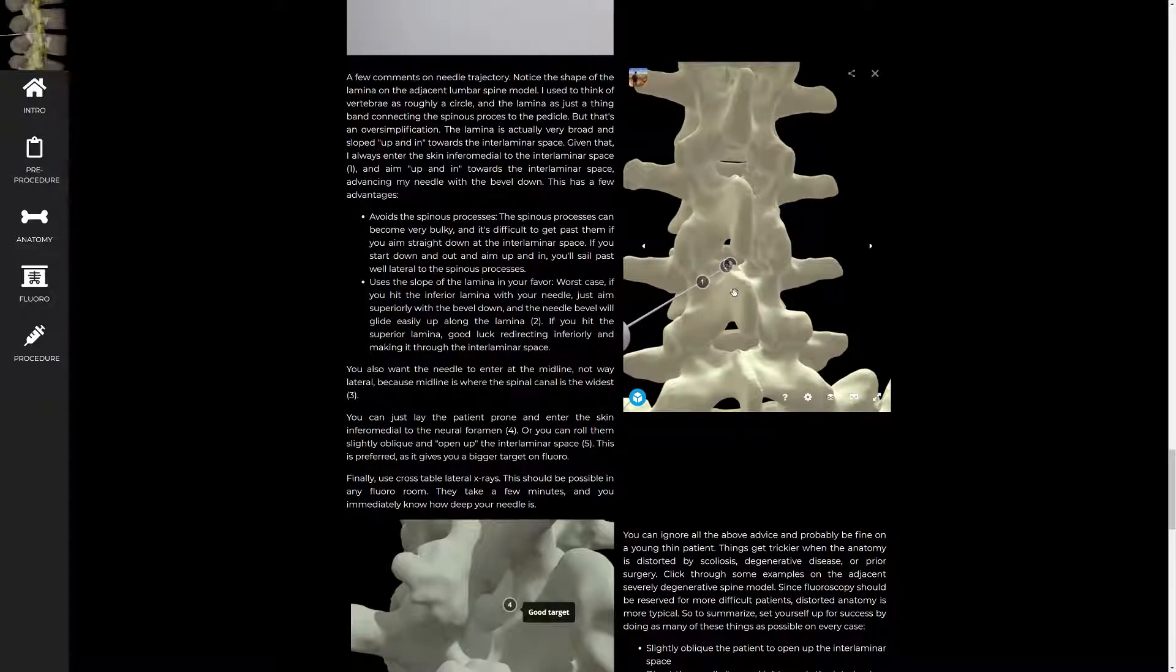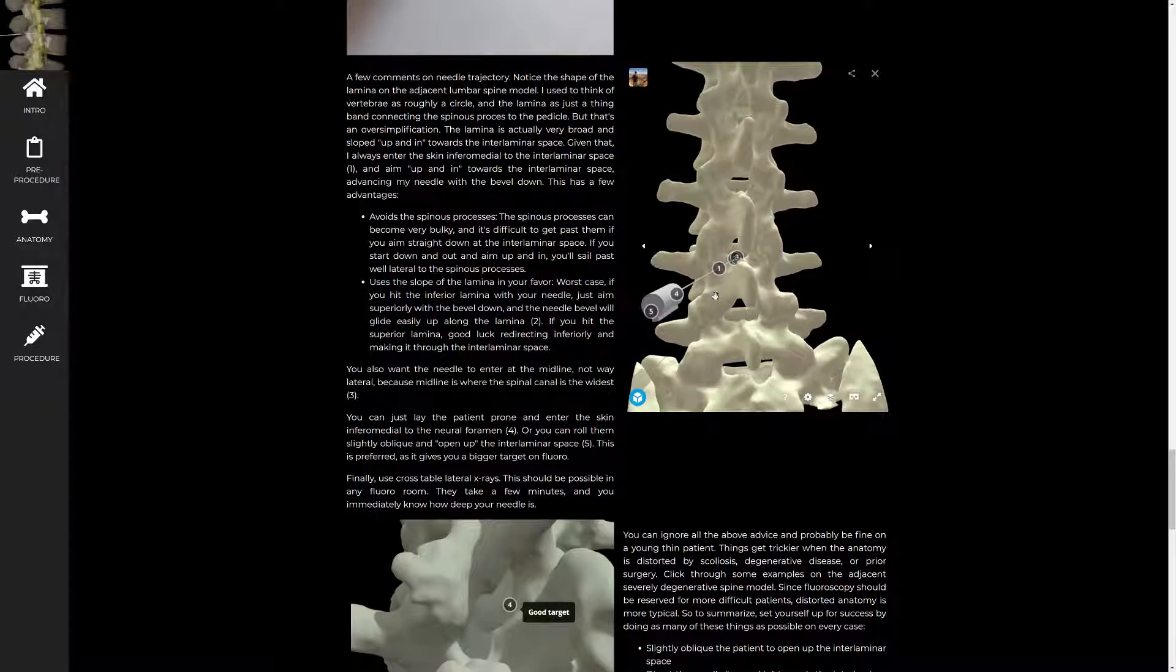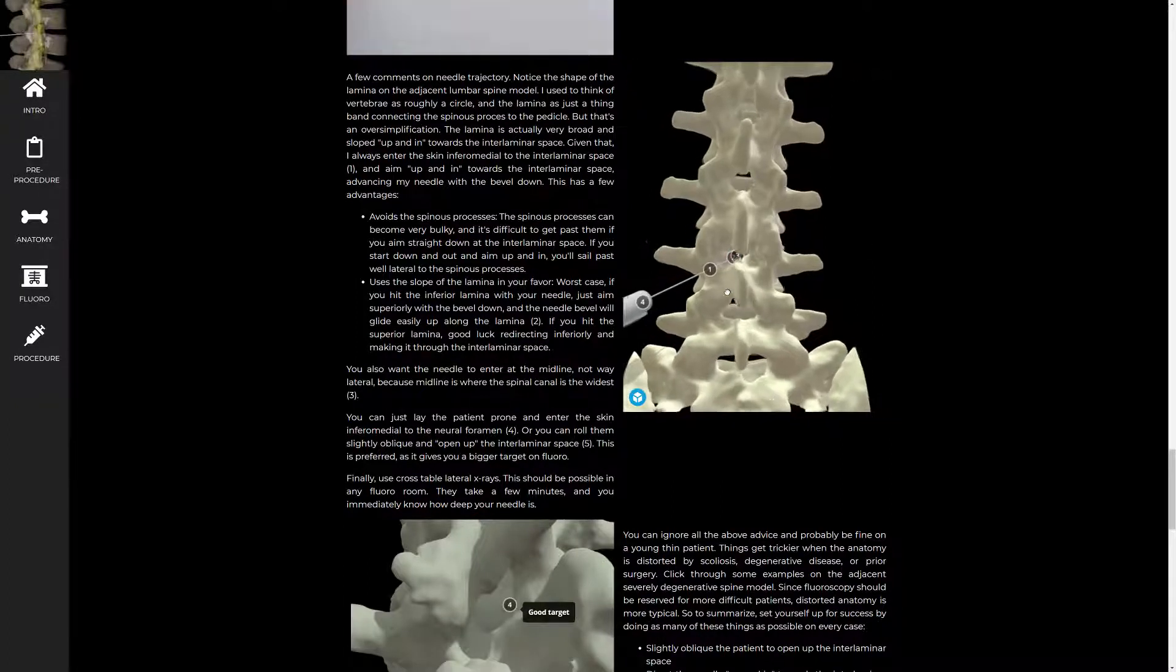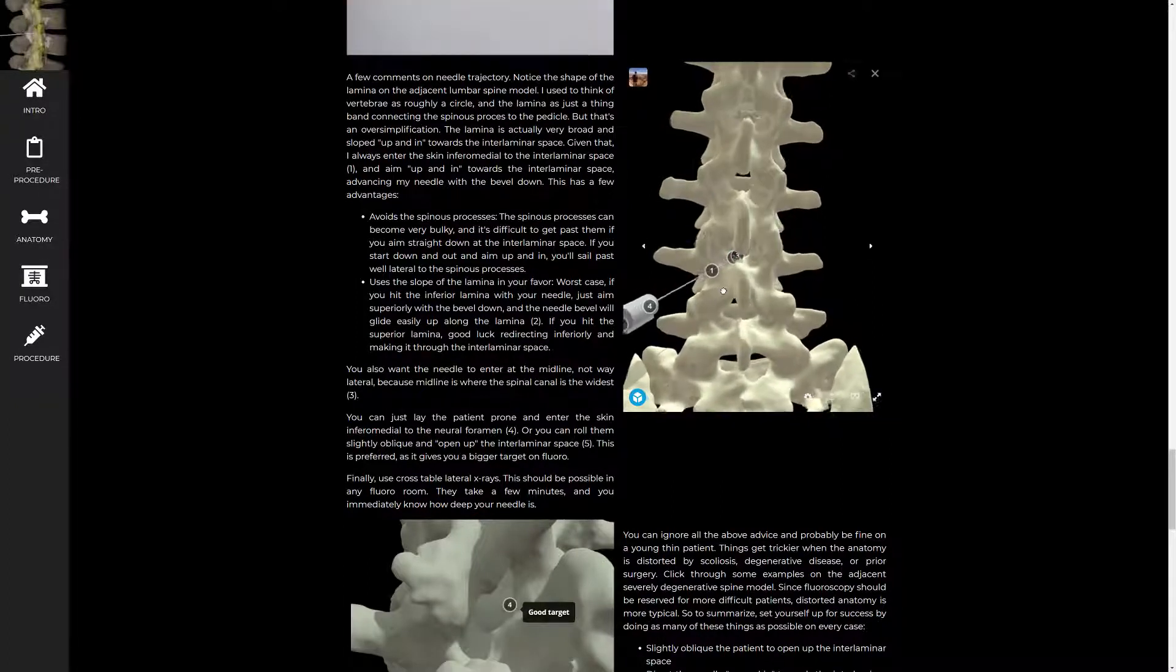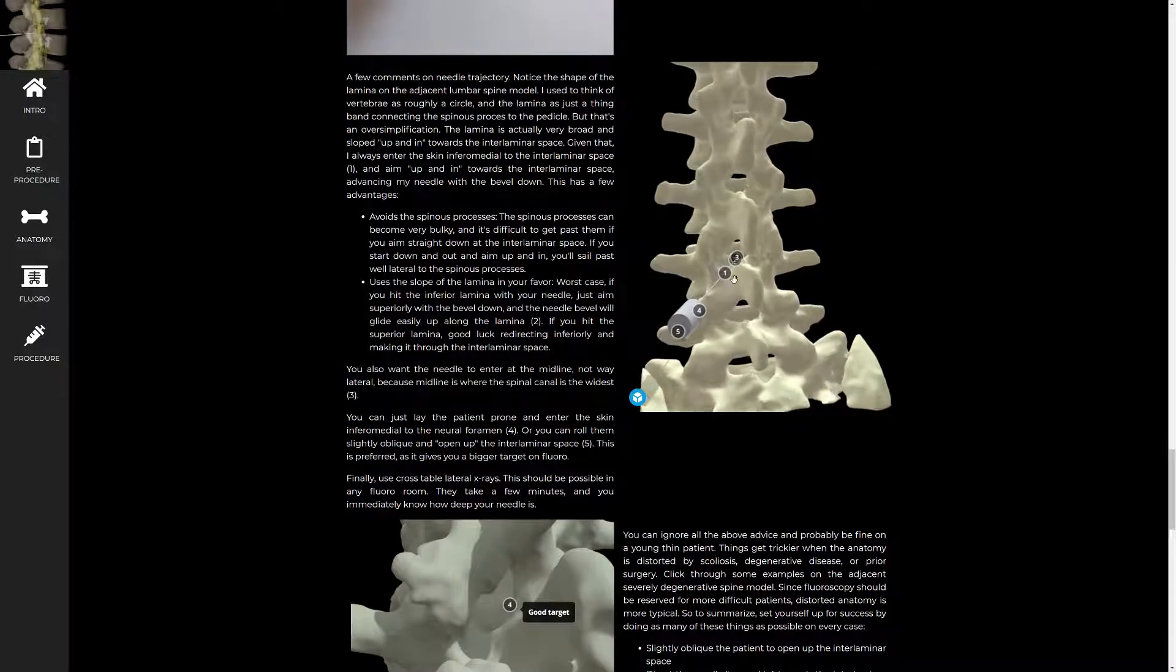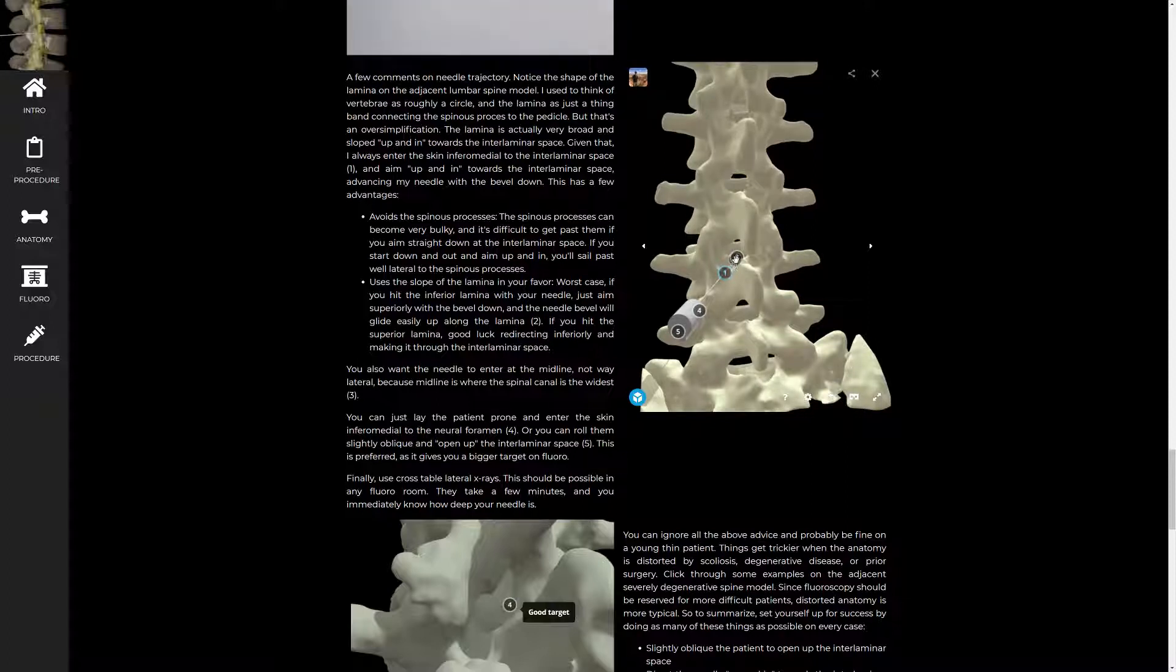This is my preferred trajectory. You can see I'm definitely not going interspinous. I tend to start down and out and aim up and in. And the reason for that is if you're going up and in, your bevel is going to be pointed down. And worst case scenario, if you hit the lamina with your bevel down, it will tend to just slide right up the bone that is actually angled up and in towards the spinal canal as well.